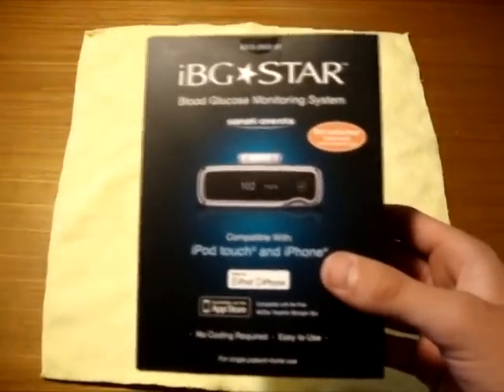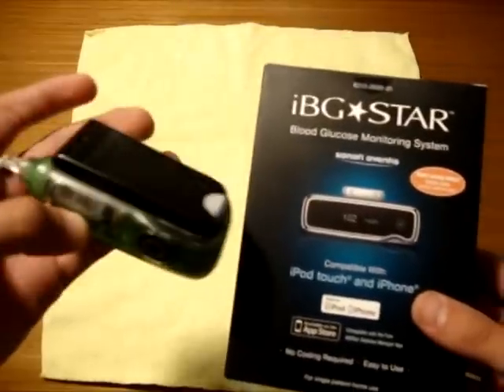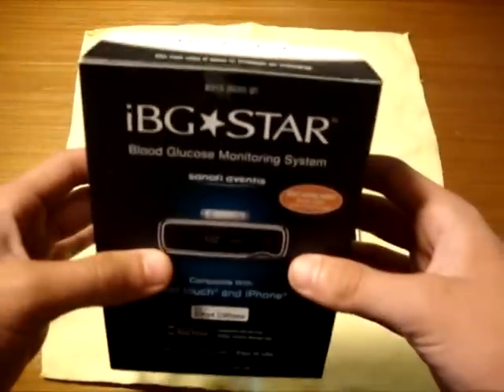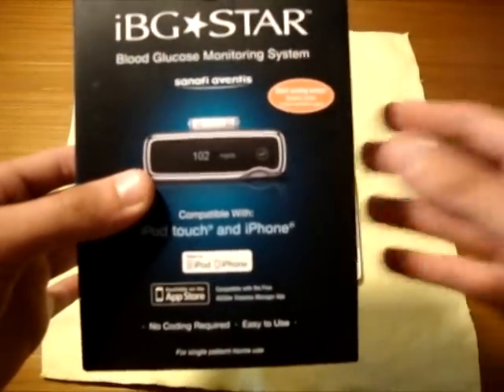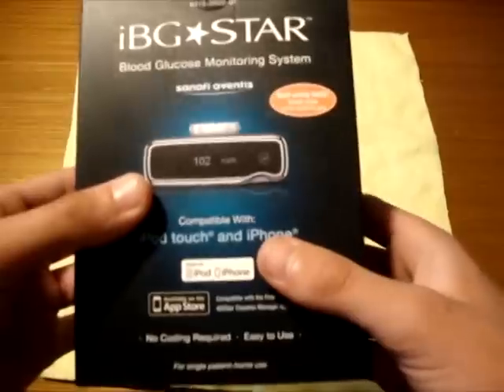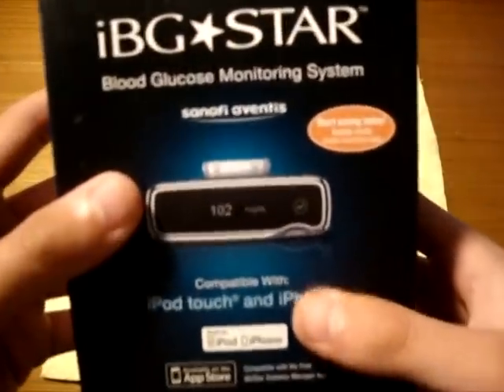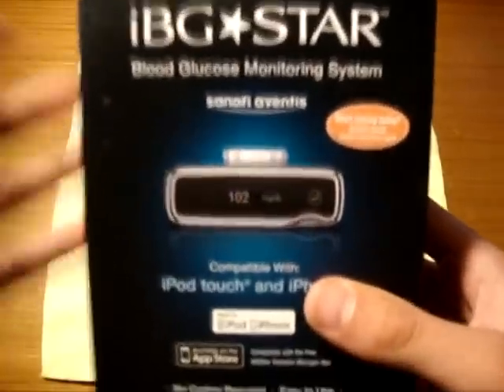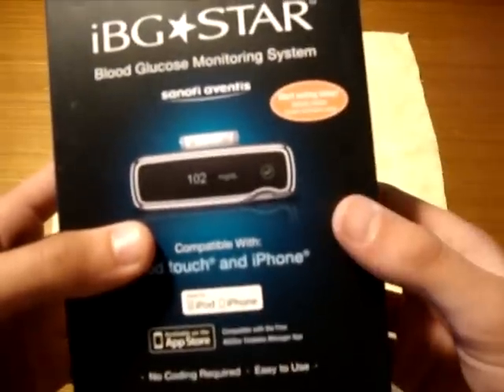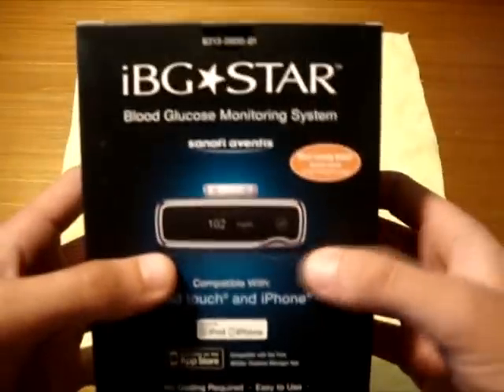I used to carry my tester on the back of my insulin pump. This one is going to attach to the bottom of my iPhone, which is really neat. It's paving the frontier for mobile devices and diabetes care and it's the first of its kind. A huge shout out to the Sanofi Aventis people for meeting with me, teaching me about this product, and letting me see what it's all about.